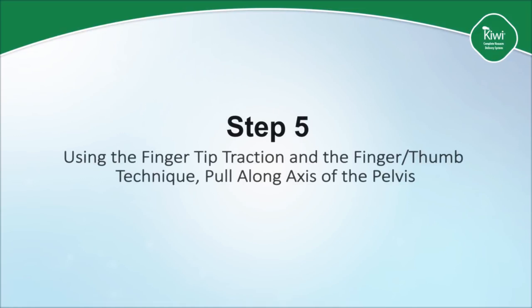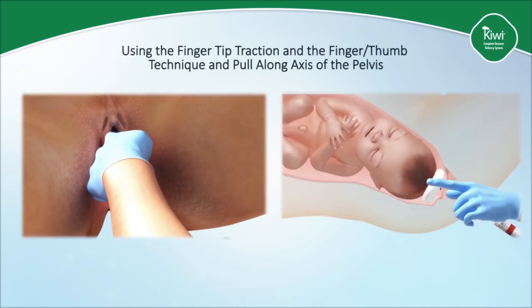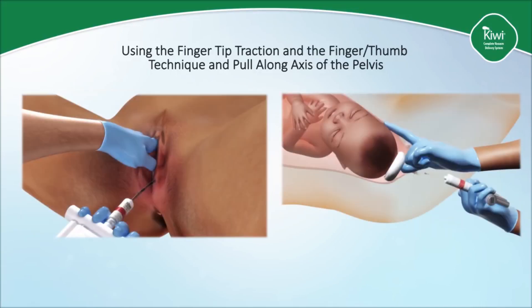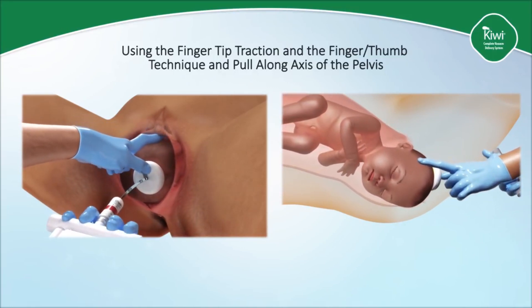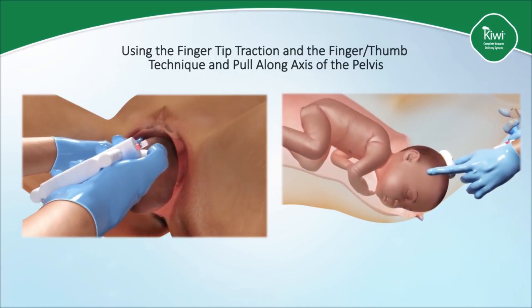Step five is to direct traction along the axis of the pelvis using the finger and thumb technique to avoid cup detachments. Press the thumb of the non-pulling hand against the backside of the cup and place the index finger on the fetal scalp to prevent cup detachment and to monitor the descent of the fetal head. Apply traction in line with the axis of the maternal pelvis. The axis will change as the fetal head descends. In general, one should maintain a 90 degree angle between the cup and the stem of the vacuum when possible. Note, this may not be possible with the first traction effort in malpositioned babies.